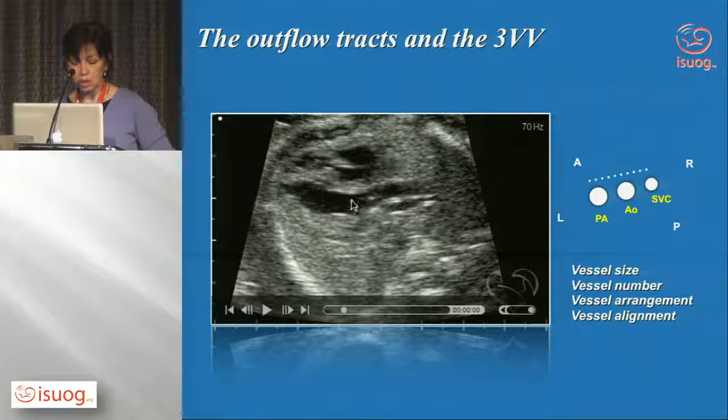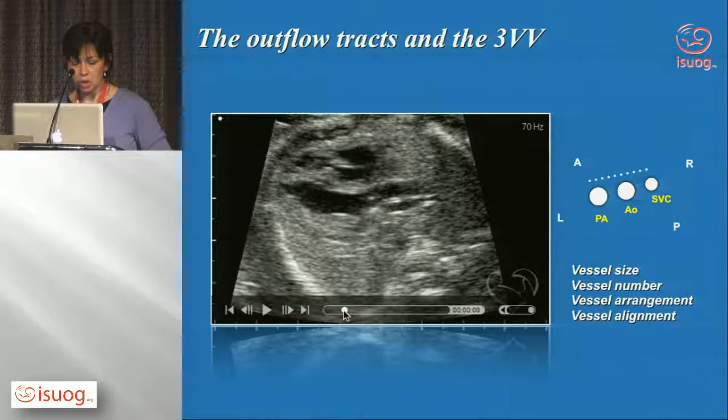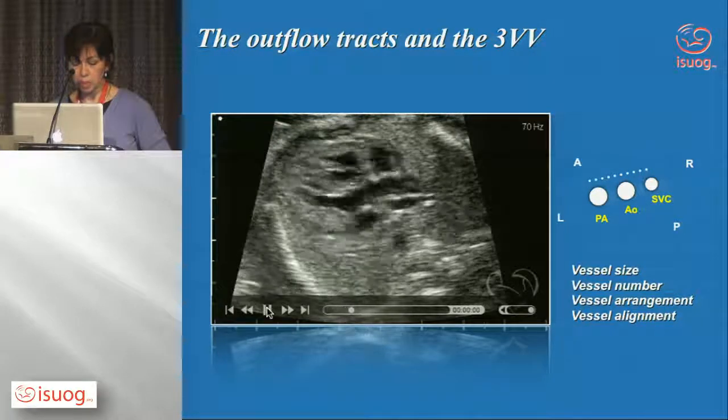It's easier in a way to see the septo-aortic continuity. The other view I showed you, you can foreshorten very much this area, and you can more easily miss a ventricular septal defect. So look at the heart from different angles as well. Is another tip for getting your good screening. That's the aortic valve, and when you're doing the outflow tract, make sure that you do see the valve open and close. When it opens you don't see it, and when it closes you just see the thin leaflets of the valve. So that's part of your left ventricular outflow tract.